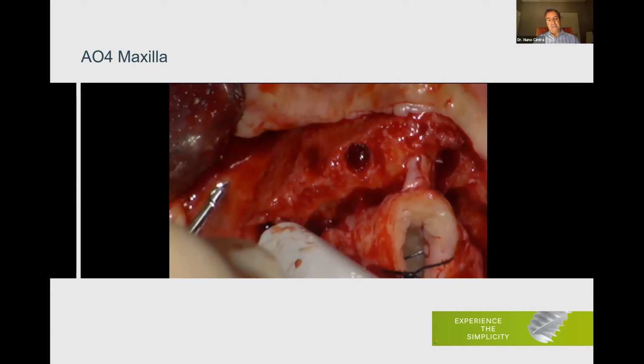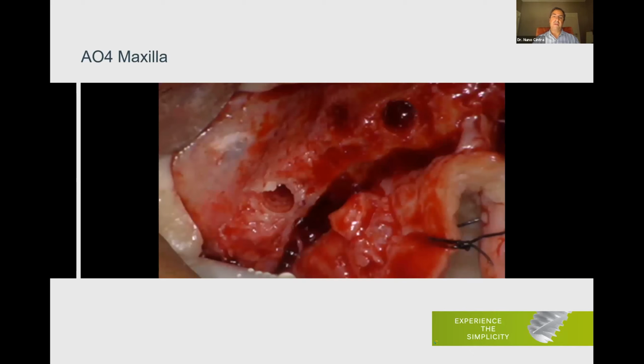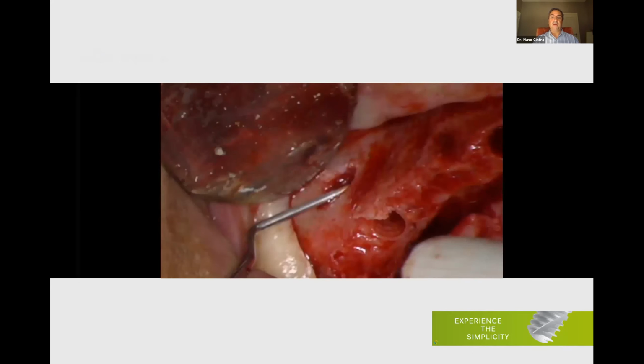What I mean is that this is the first step, which is opening the sinus. Make a small opening on the external wall of the sinus in a way that we are able to see the membrane and push the membrane inward. I'm not saying to perforate the membrane. I'm saying to push the membrane inwards so we can introduce a blunt probe, and this is the best way for us to see where the anterior wall of the sinus is, because that will be our posterior limit of our surgical field.